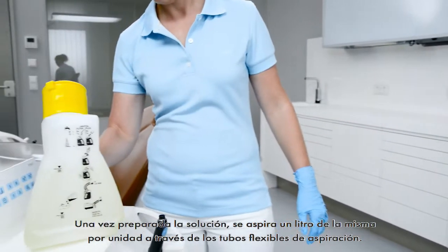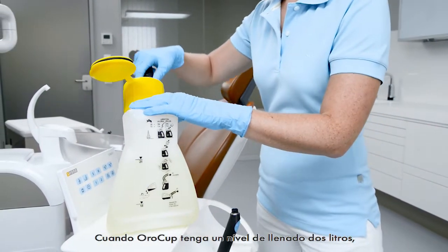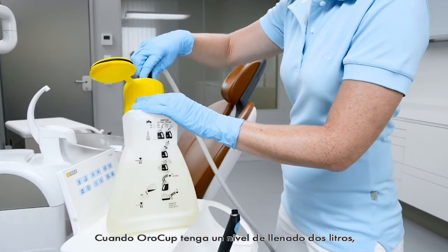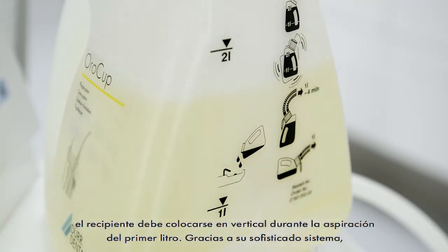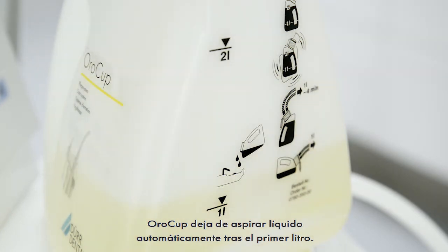After the preparation of the solution, 1 litre of the ready-to-use solution per unit is aspirated via the suction hoses. With a filling level of 2 litres, the OroCup must be positioned upright during the suction of the first litre. Thanks to the sophisticated system, the OroCup automatically stops the intake of liquid after 1 litre.